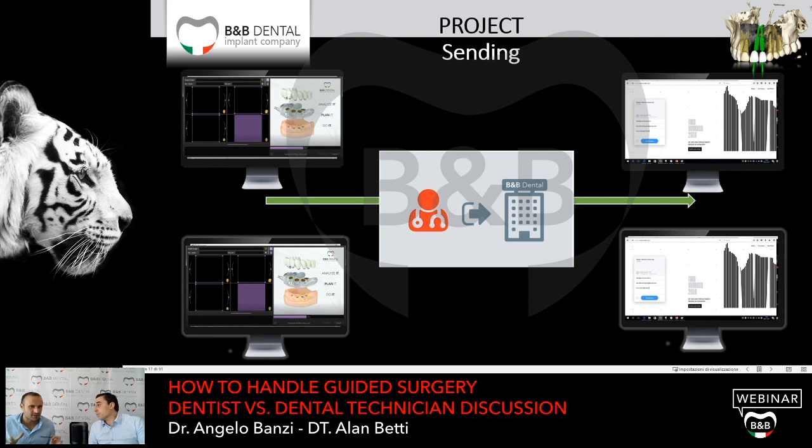The range of tolerance is 15 degrees between one implant and another, which is not a problem, because the multi-unit abutment has a little cone on it, and you can handle this situation.